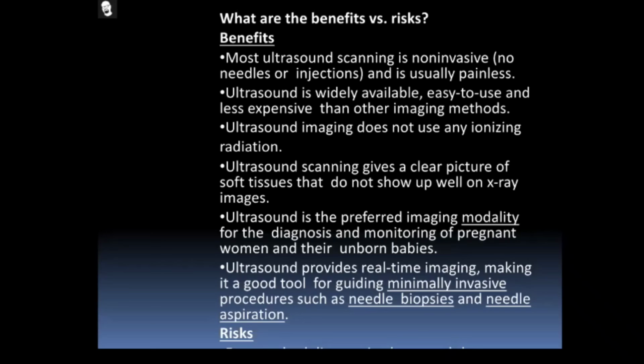Ultrasound scanning gives a clear picture of the soft tissues that do not show up well on X-ray images. If the doctor can't predict using the ultrasound scan, then he suggests the patient go for X-ray or CT. If the doctor can diagnose what happened in the internal organ, then he does not suggest any other imaging techniques. So the first option is ultrasound.